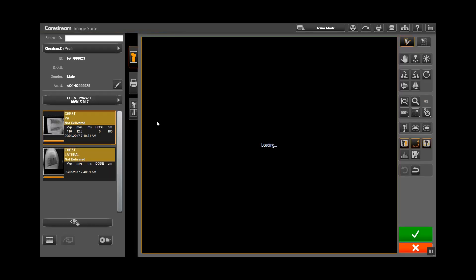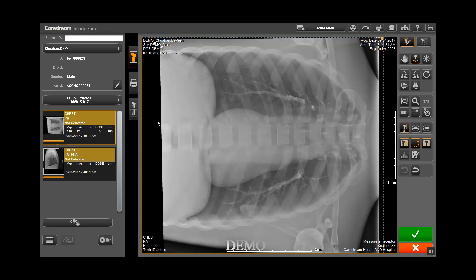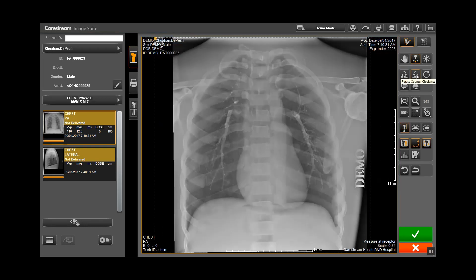For purposes of this video, we will proceed as if you had just scanned the patient image. Rotate the image by clicking on the Rotate 90 degrees counterclockwise button.